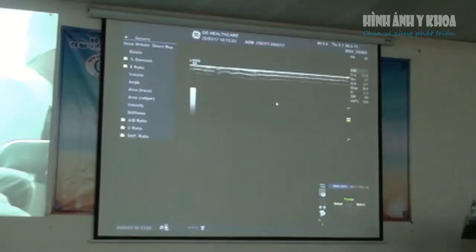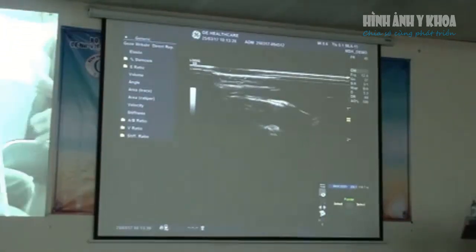So I just get the patient to pop their hand onto their opposite shoulder. And a lot of the time the patient will keep their arm out. You need to push their elbow down next to their chest. So to find this, just go down and see how he's doing this with his shoulder. We need them to relax.